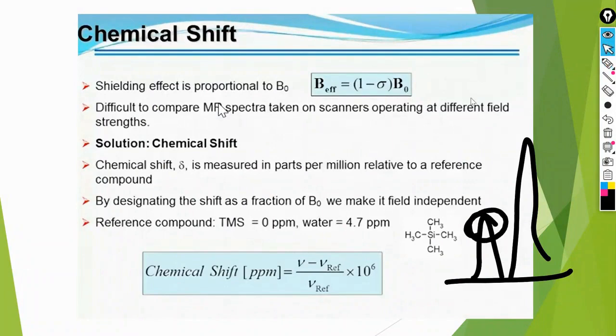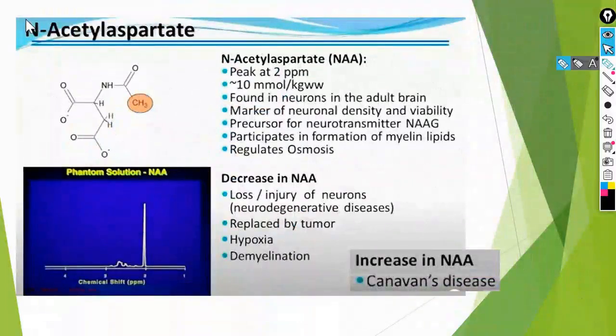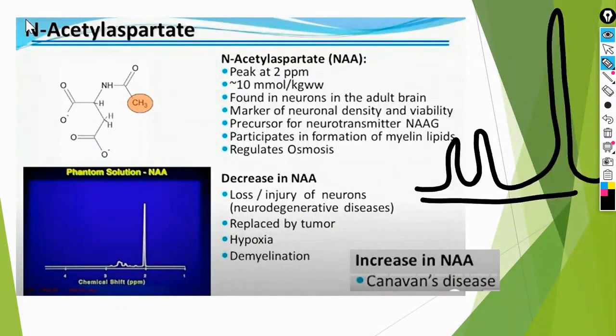Now, let's take creatine as an example. The same idea applies. For example, if you have a high grade of astrocytomas, it starts to show in its signal. Creatine is also a distinctive and reliable marker. Normally, its peak is very close to that of choline, with both being quite similar. And this is the characteristic style of the spectrum we observe. This gives you an indication of a specific issue, and these give you indications of other things. Each one of them, or the peak itself, shows how it looks.